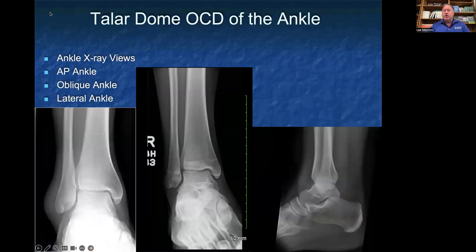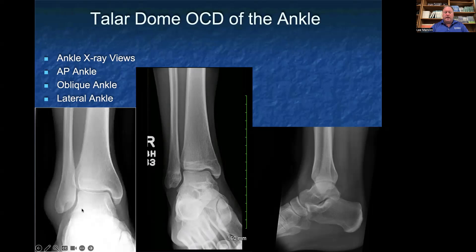Our first area to discuss is a talar dome OCD of the ankle joint. Typically, when you're getting x-rays of the ankle, you always want to get them weight-bearing, and you want to get three views: an AP view of the ankle, an oblique view of the ankle, and a lateral view of the ankle. The bottom left view is your AP ankle view, the middle x-ray is your oblique ankle x-ray, and the far right is your lateral ankle x-ray.